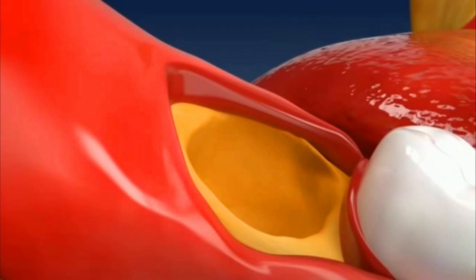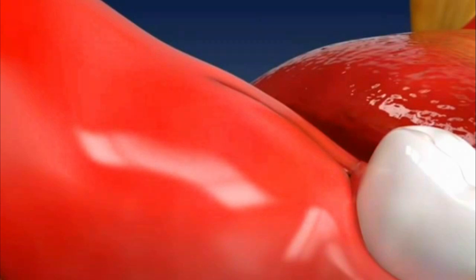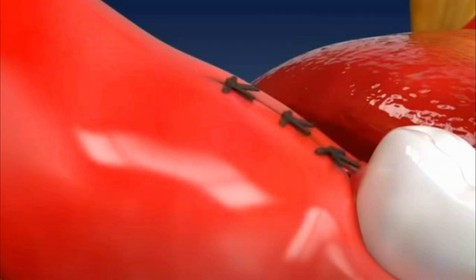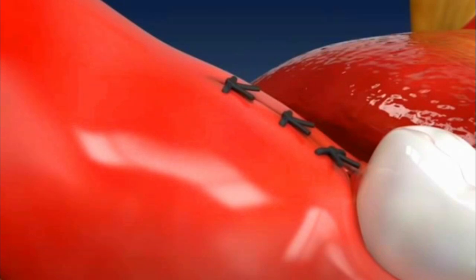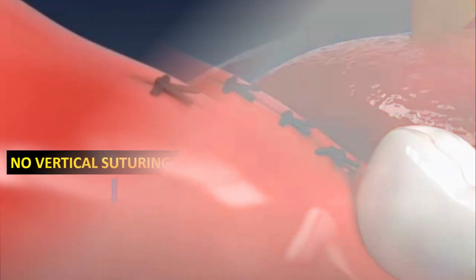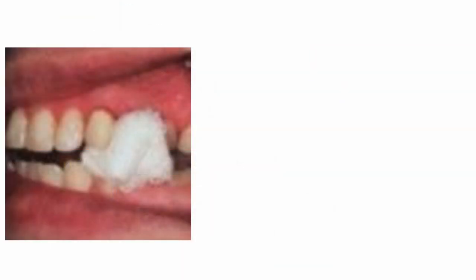Wound conditioning is done — the bony crypt that housed the wisdom tooth is cleaned with saline water. Finally, suturing and dressing is done. The gum flap is laid back and sutures are used to hold it in place — generally two to three non-absorbable 3-0 silk sutures with a cutting needle are preferred.